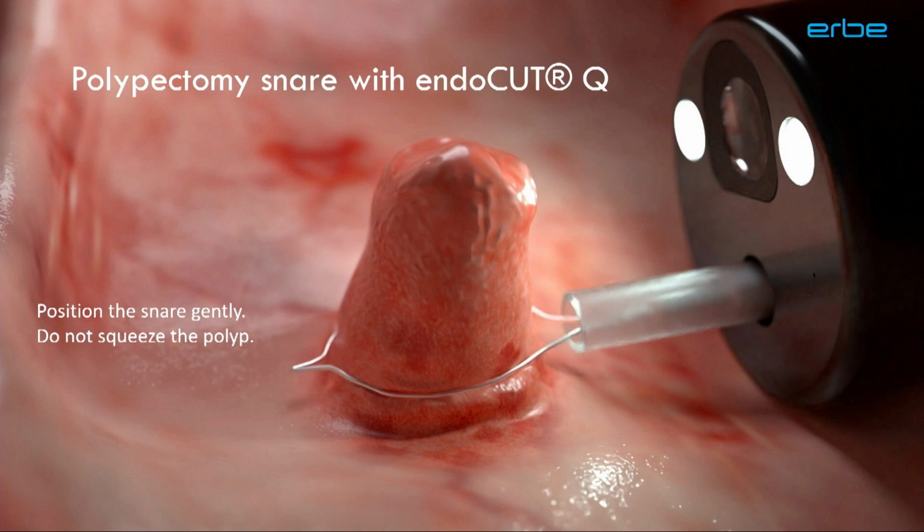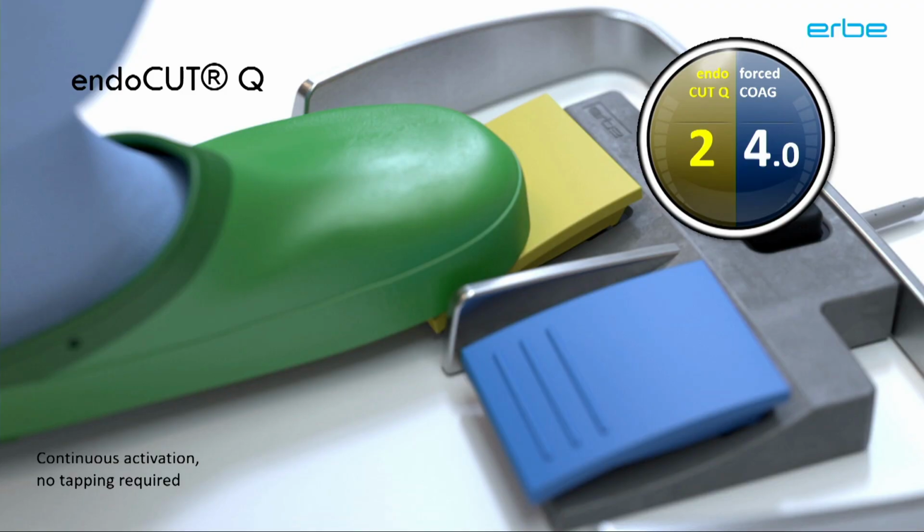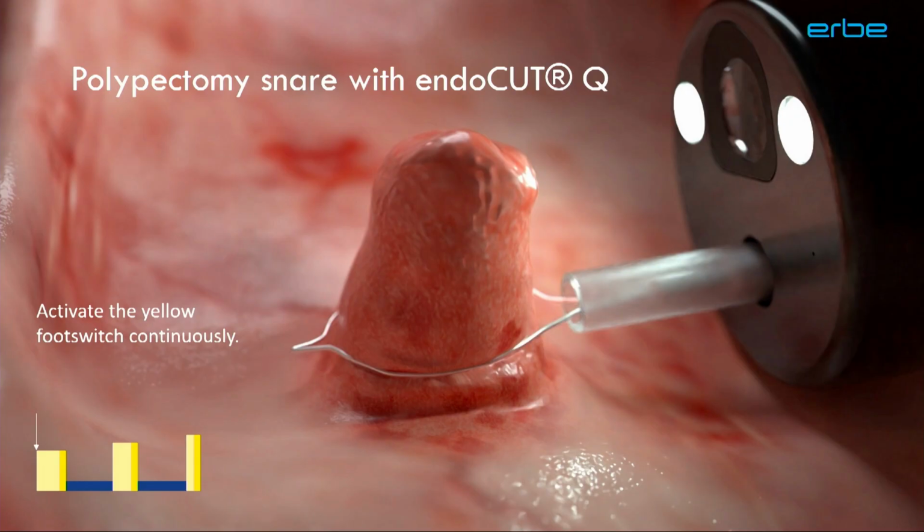So the right position is to gently put the snare around the polyp. Then you press the yellow pedal. Maybe you can start with a big polyp with pre-coagulation with the blue pedal, but when you start your Endocut or the dissection of the polyp, you push the yellow pedal. You keep your foot on the yellow pedal until the total polypectomy has been done.